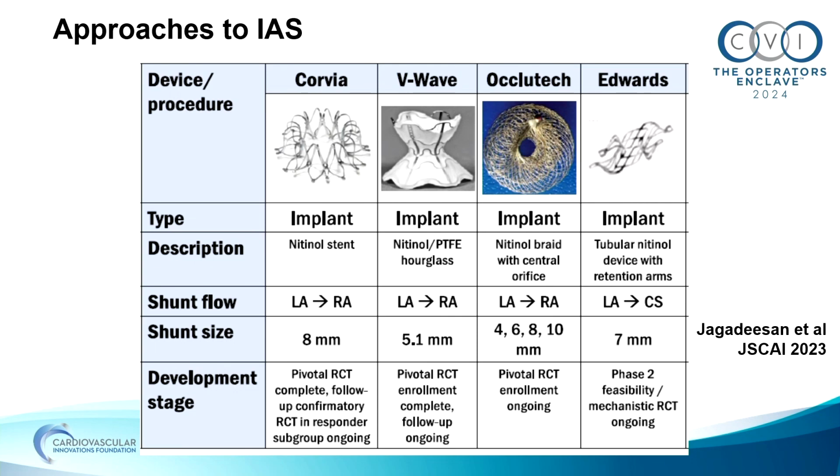I'll update the development stage a little bit here. The V-Wave, as you know, was presented a couple months ago at the ACC. And Occlutech actually has been halted. Their pivotal trial, FROST-HF, has been halted for some reason. We'll talk a little bit more about this at the end.